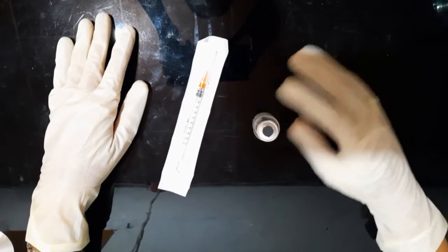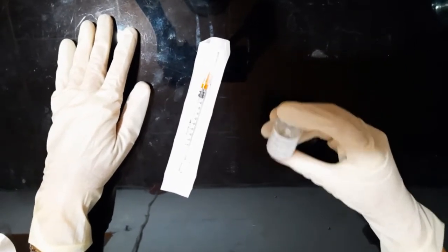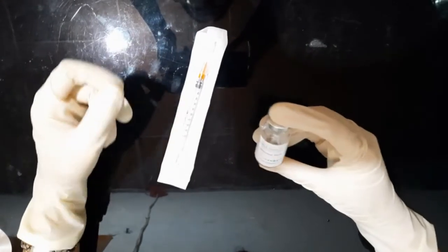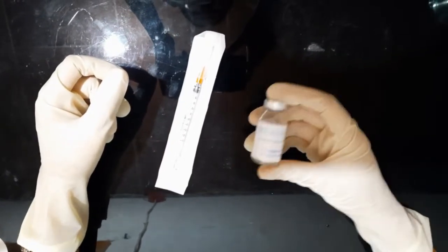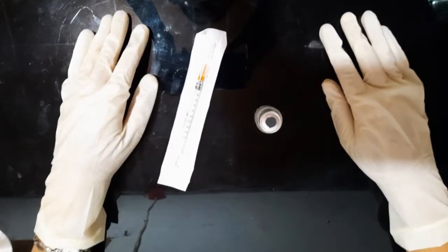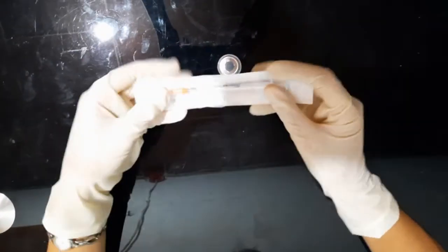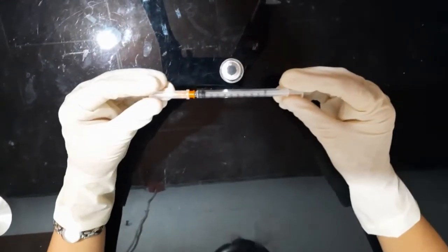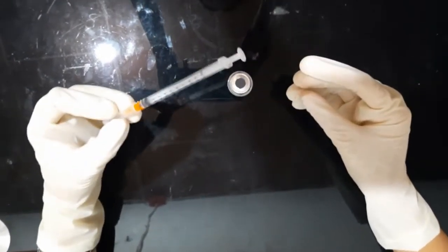Remember when we were dealing with the vial, we have to check for the expiration date, the lot number, and the manufacturer. This is a tuberculin syringe.